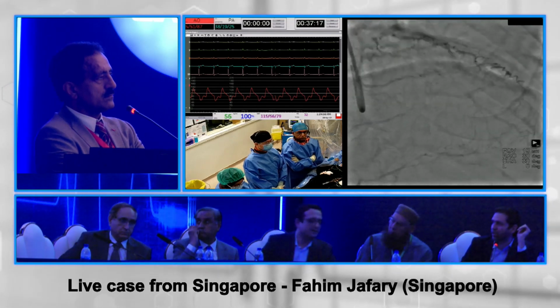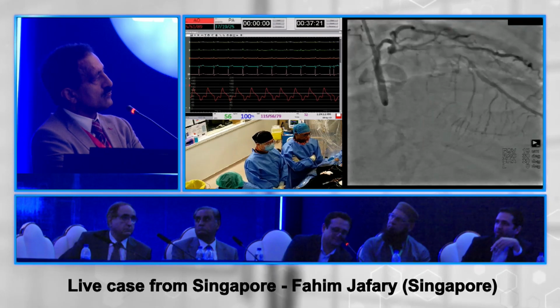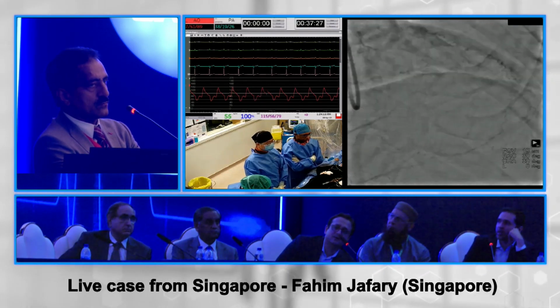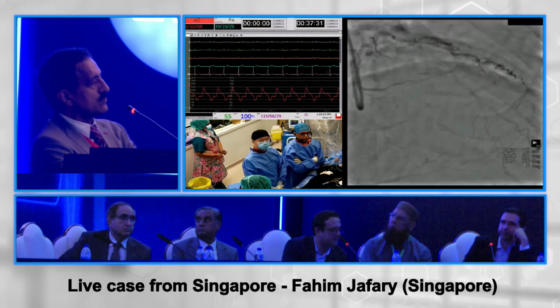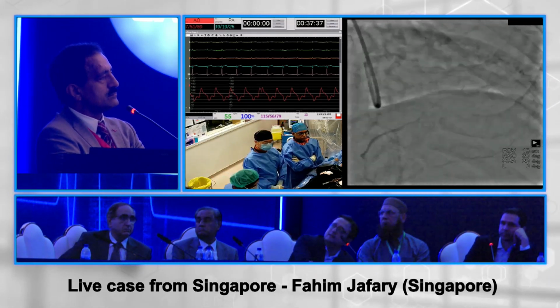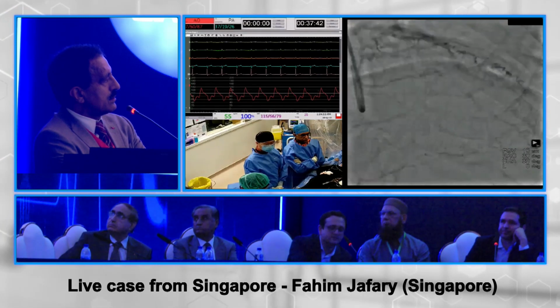Asad, you use a lot of rota. What about the diagonal protection when you're doing that atherectomy? So actually with atherectomy, the chances of preserving the side branch are better because you are shaving off the calcium. So plaque shift is actually less until you NC balloon it after rotablation. So by that time you can have the wire in, and there's TIMI 3 flow in that diag. So hopefully you should be able to preserve that.